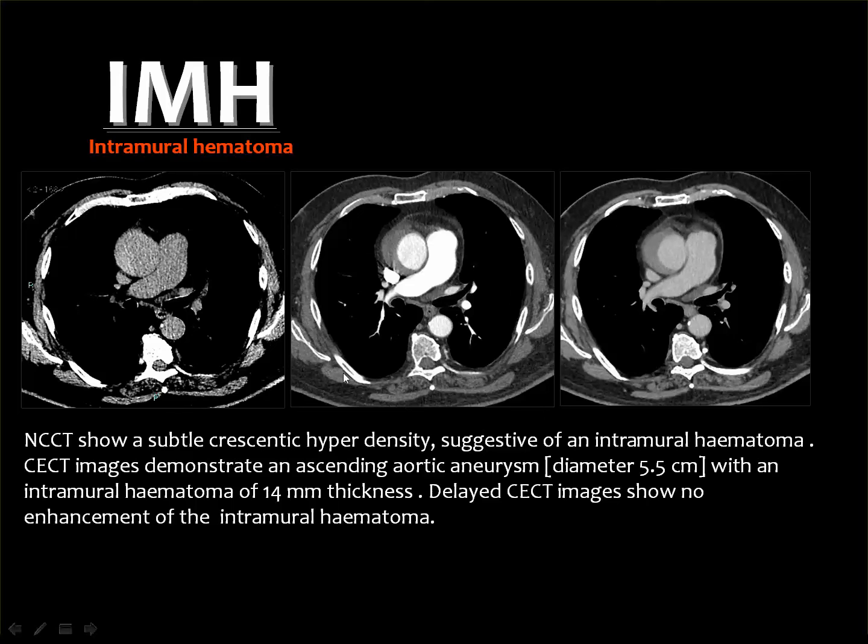But in the pre-contrast scans in cases of intramural hematoma, you can see the relative hyperdensity. This is not a very good quality image, but you can see the relatively hyperdense hematoma inside the wall of the aorta. After injection of contrast, you get an appearance similar to dissection. But if you wait for some time, the hematoma will not enhance.